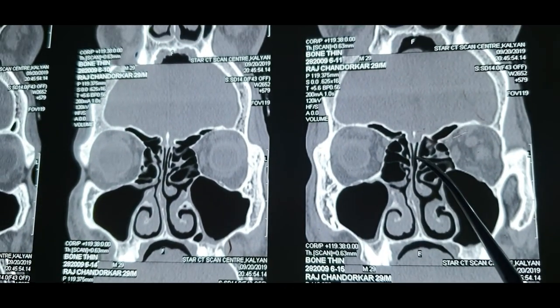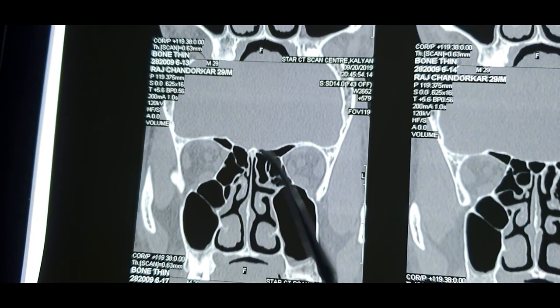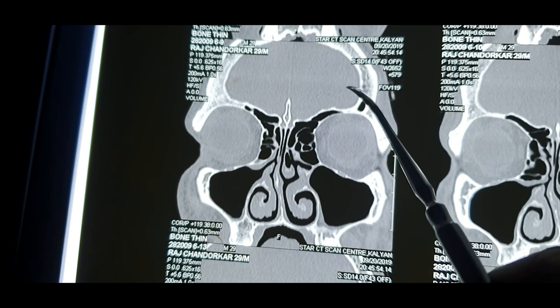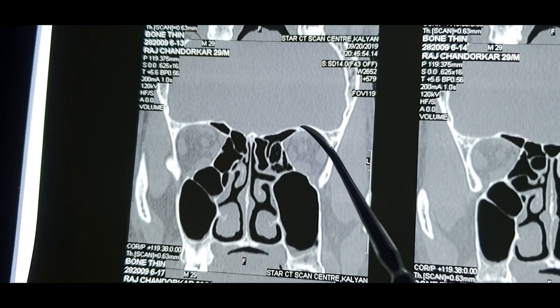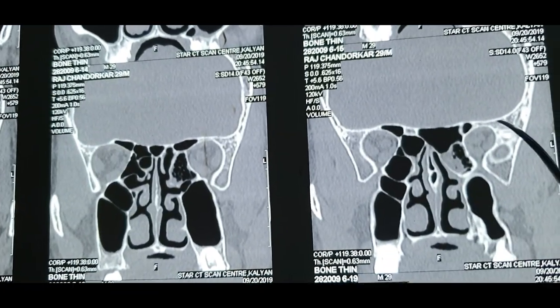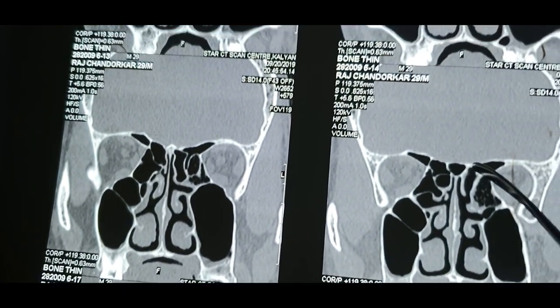structure. This is the ground lamella, and the moment you go behind it, see, it becomes flat. See here, this is sloping like this, eyebrow shaped. This is sloping like this, and look at this. This is almost horizontal. See this, almost flat. And how was this? Sloping. And how is this? Flat. This is the fourth change.